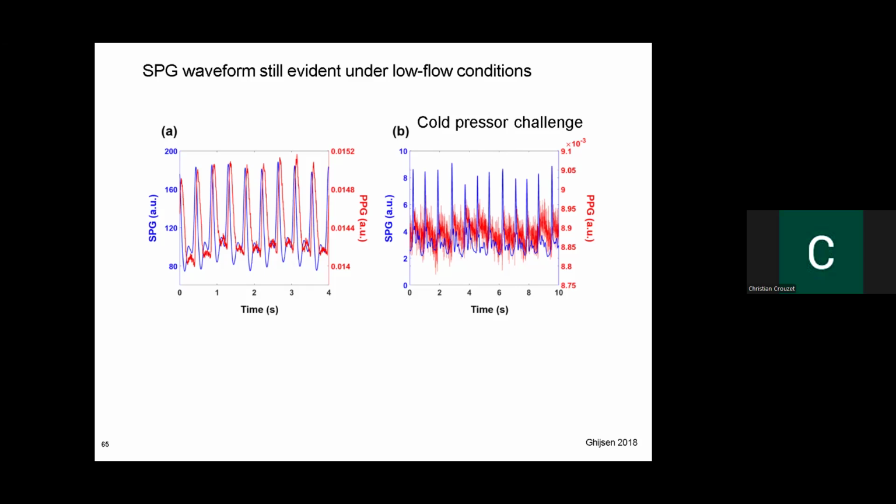I think it's worth investigating because non-invasive blood pressure is obviously quite a large field, and potentially having multiple LSI-based devices to look at this could do that. It's definitely something we're interested in. It's been a bit more challenging than expected with some of the factors that go into it, but I definitely think there's still an avenue where SPG can be used to get non-invasive blood pressure.